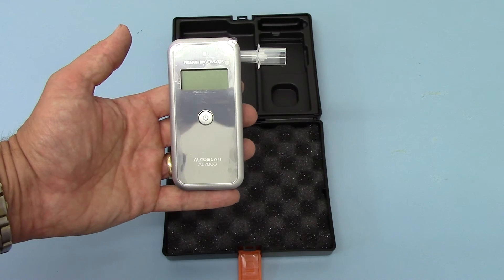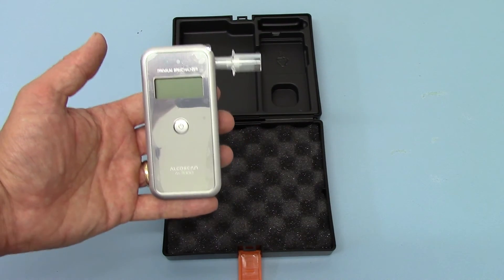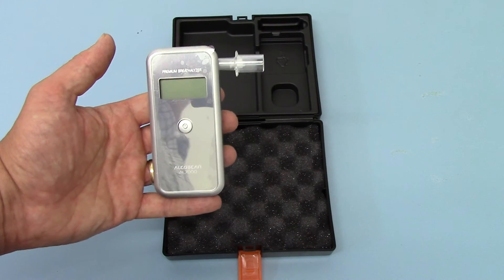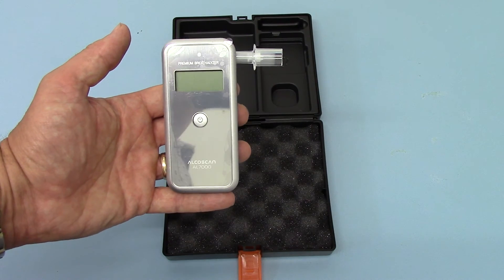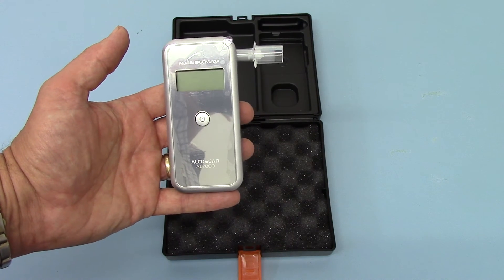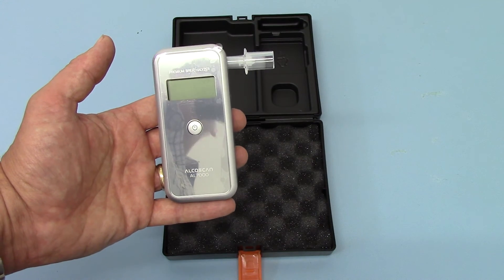So we've demonstrated the AL7000 — how easy and quick it is to do a spot check of breath alcohol content. These display breath alcohol content directly in milligrams per litre. It's important to realise the scales these units display in. There are two common scales: breath alcohol concentration and blood alcohol concentration.